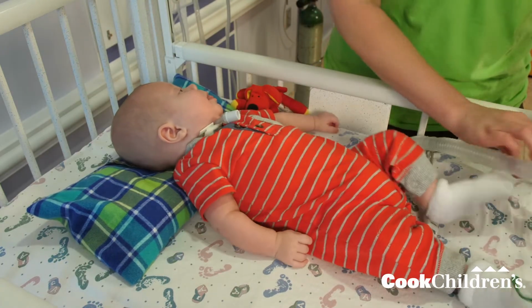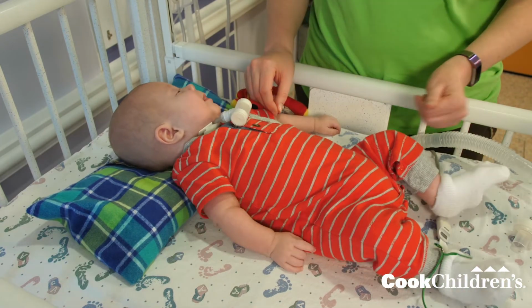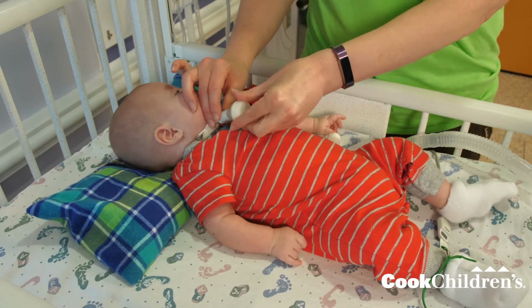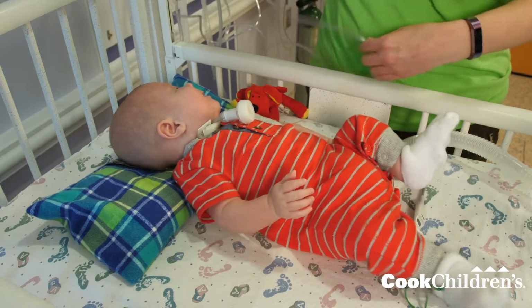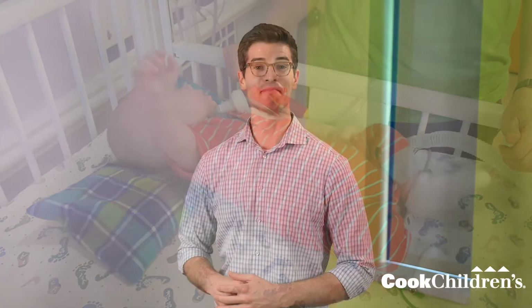There are 2 types of HMEs. These are the HME and the HME with oxygen. Both HMEs attach to the end of the trach tube. Remember that oxygen and humidification are very important for your child's health.